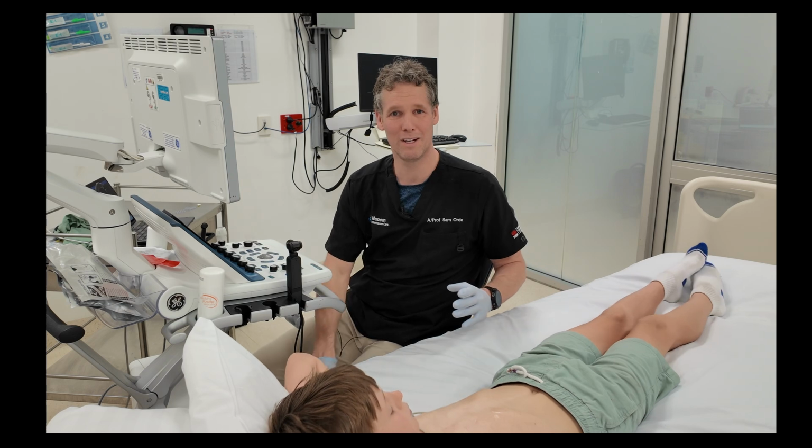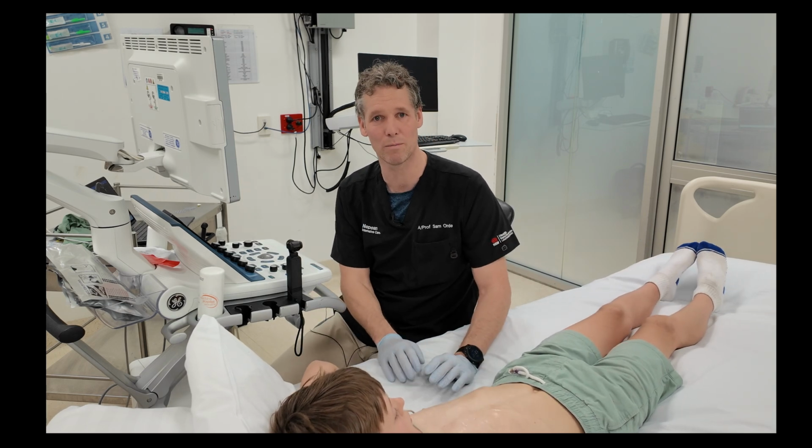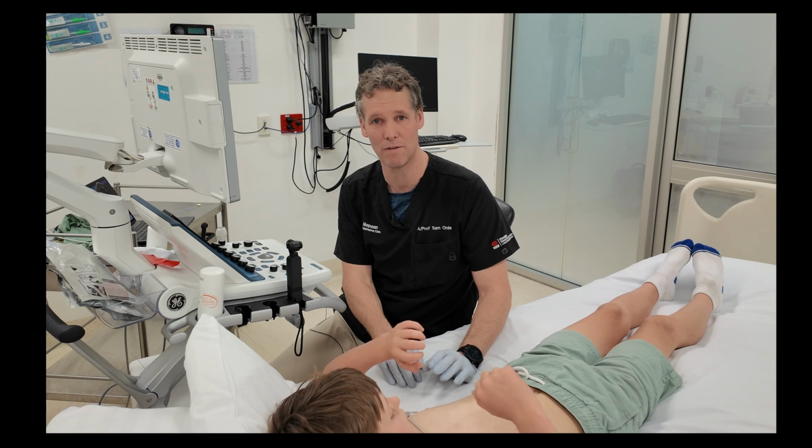I hope that was useful. Just a demonstration of how to do a quick point of care ultrasound scan for the heart and the lungs.